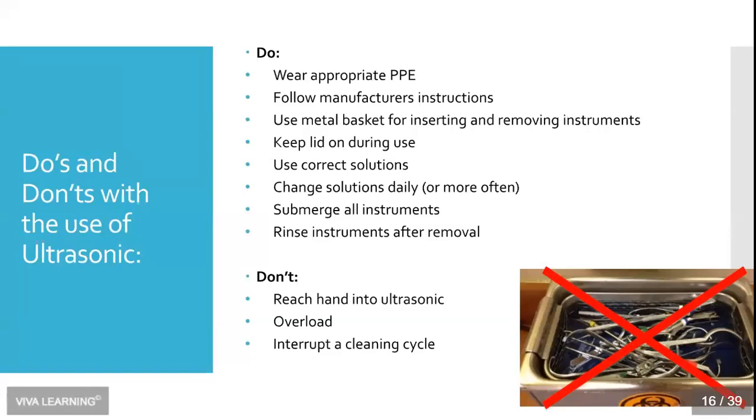Number one, still wear your personal protective equipment, as these ultrasonic waves generate bubbles and such. Aerosols are also generated. We don't want any of those to splash onto your face or your skin or your mucosal tissues. So always wear PPE when using an ultrasonic. And once again, follow your manufacturer's instructions.